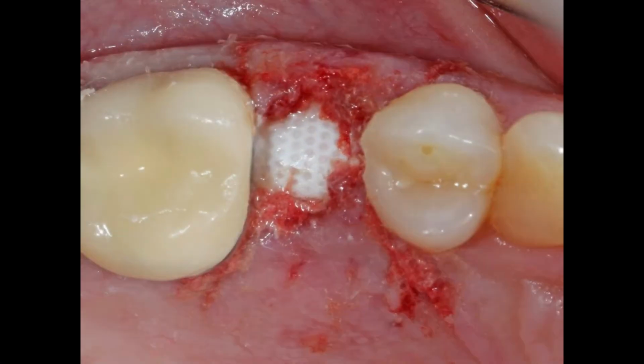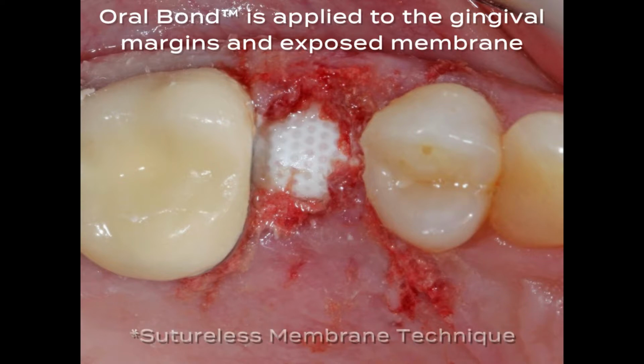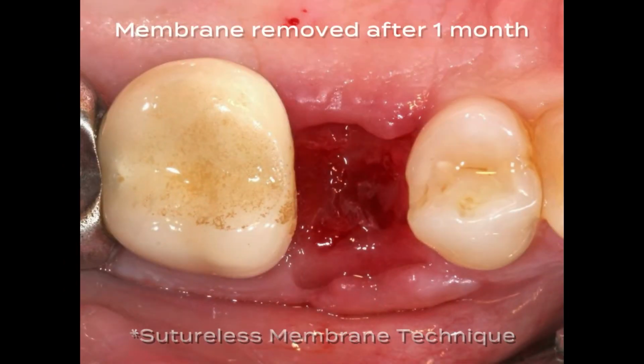After grafting, cover the material with a dense PTFE membrane. Do not use animal or human membranes, as they will compromise the results of this material. Remove the membrane after 1 month, exposing the soft connective tissue of mineralizing bone.